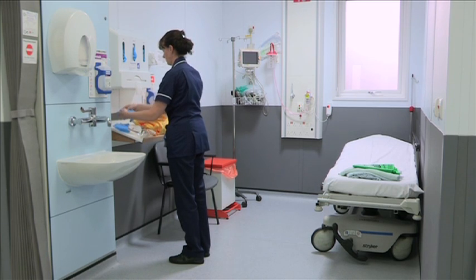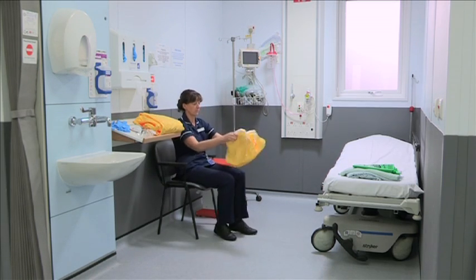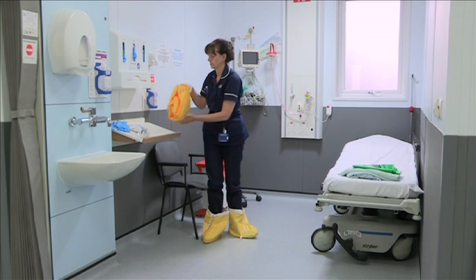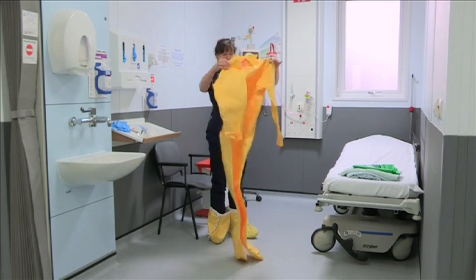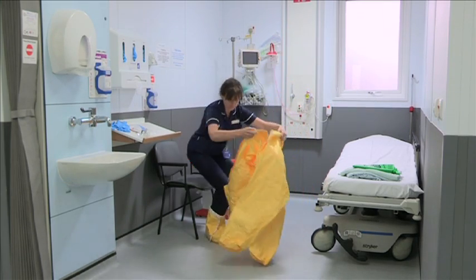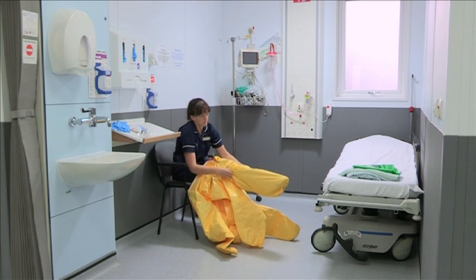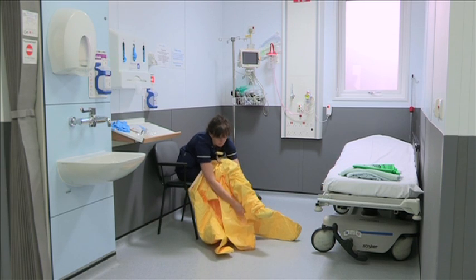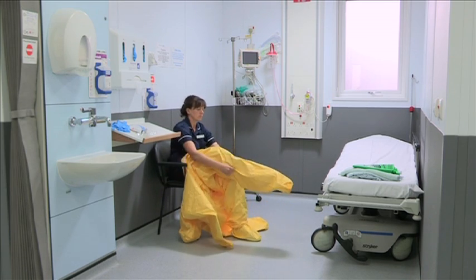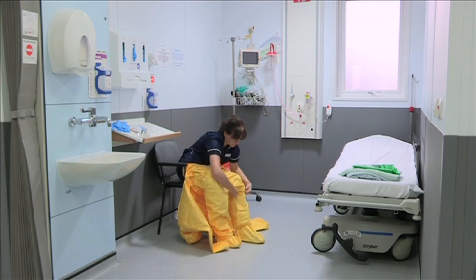Put on the scrubsuit outside of the room in which you're caring for the patient. Put on the impermeable overshoes. Place the impermeable gown over your scrubs or uniform.